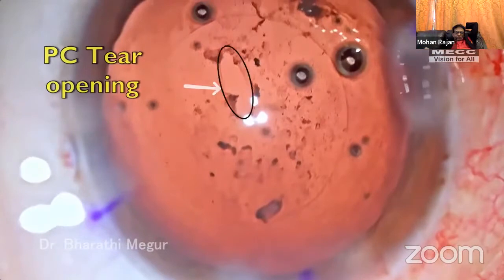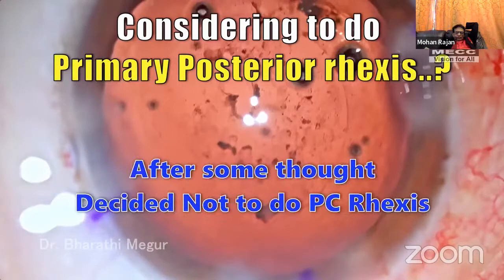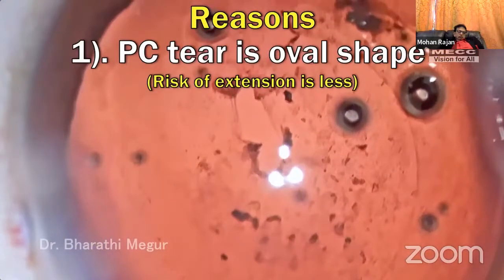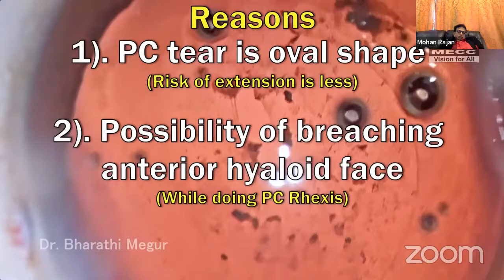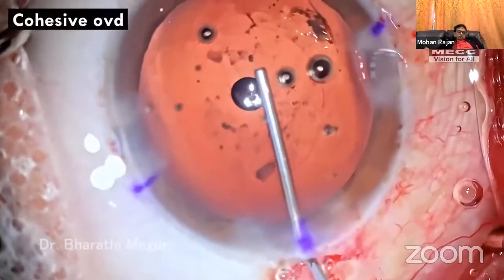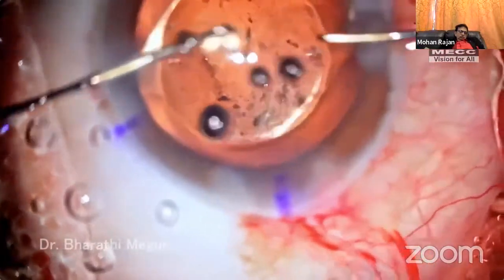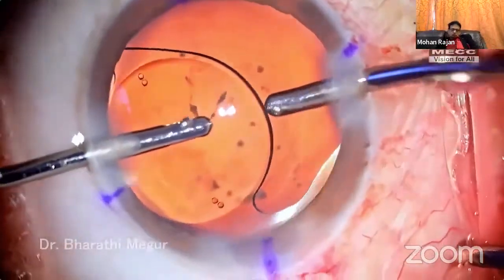The tear is oval. At this point, I am considering doing a primary posterior capsulorhexis. After some deliberation, I went against it for two reasons. Firstly, the tear was oval and the risk of extension did not seem likely. Second, there was the possibility of a breach in the anterior hyaloid face while doing a primary posterior capsulorhexis. I use cohesive OVD to form the anterior chamber and the bag. The toric lens is gently implanted into the bag.